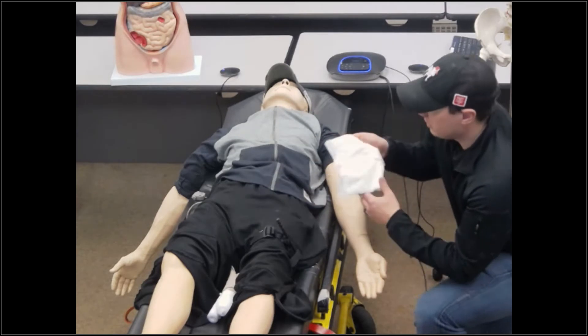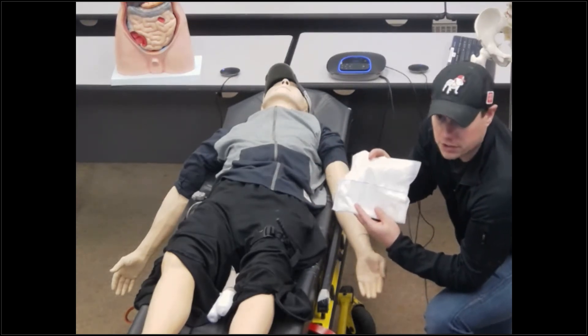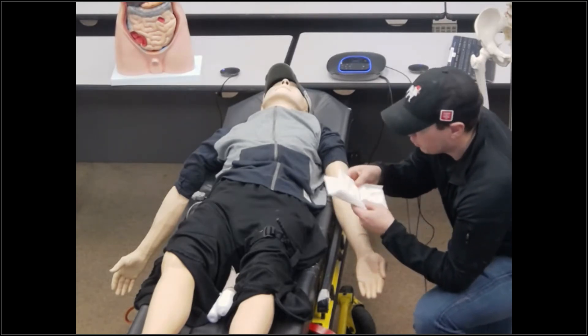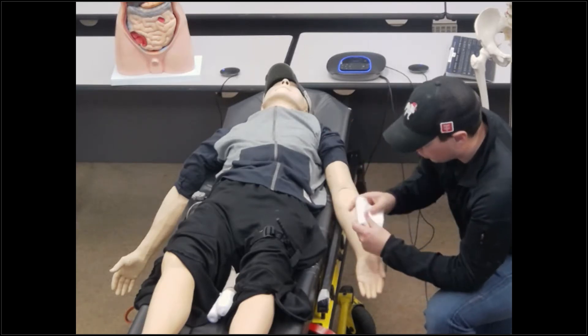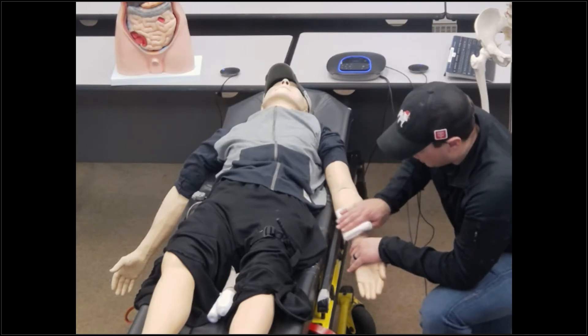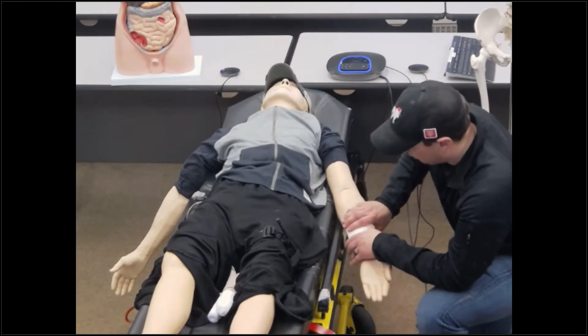My gloves are on. I go ahead and select my gauze. Remember, gauze comes in a variety of different sizes — 2x2s all the way up to our multi-system trauma dressing, which is 10x30. I've identified my site bleeding because I exposed that arm and found it. If it looks dirty, I can go ahead and cleanse it. If not, only cleanse that wound if it's dirty.